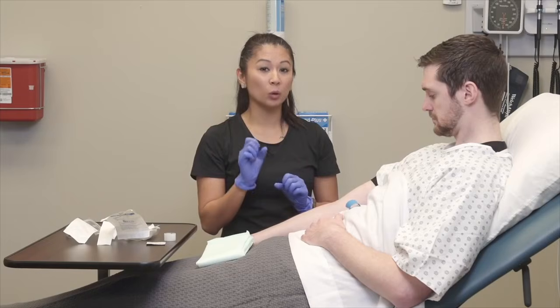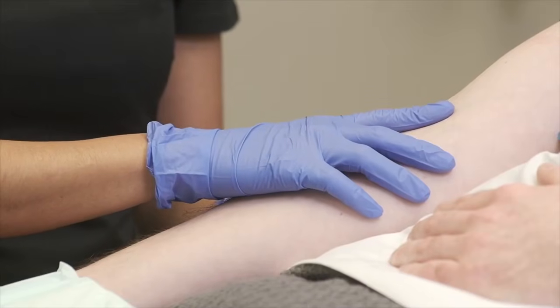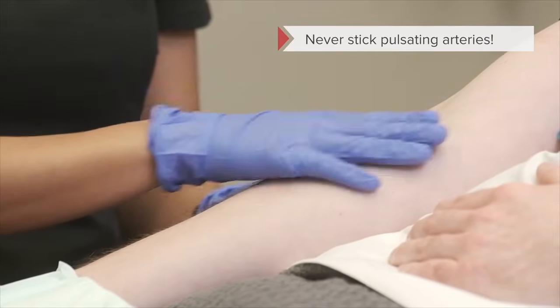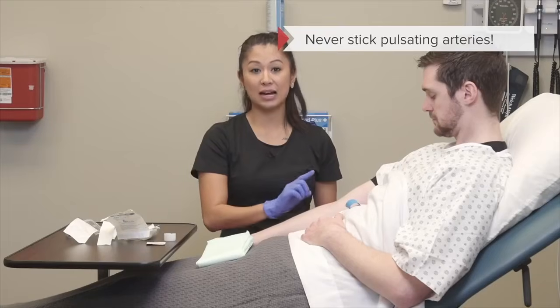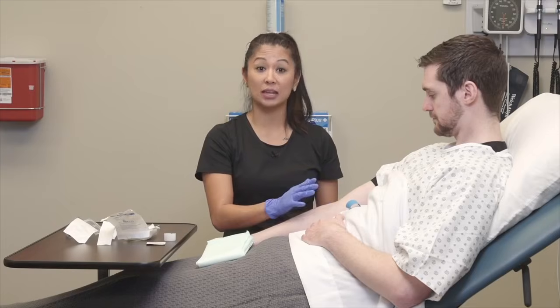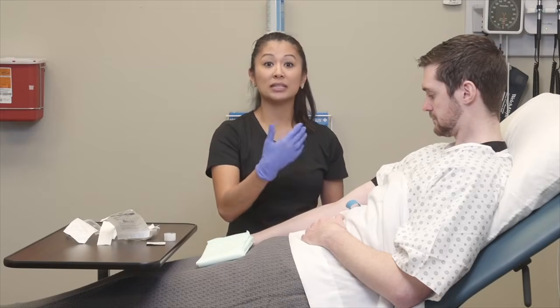All right, one more really important key. If you're in this area and you're going to feel a vein and you feel a pulse, that is an artery. Do not stick that. I'll say that one more time. If you're in this area and you feel or see a pulsating, that is not what we want to stick. That is an artery, not a vein. And this is peripheral IV insertion. So just keep that in mind. All right. So once we've identified that site, considering all those things, release the tourniquet.